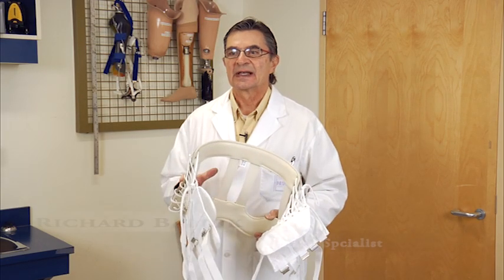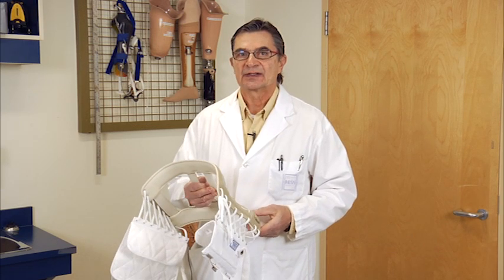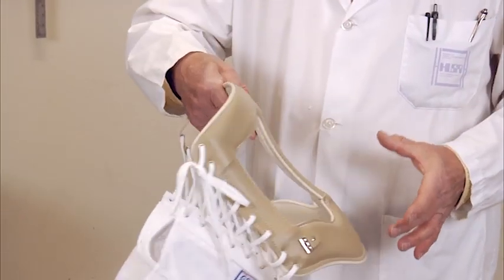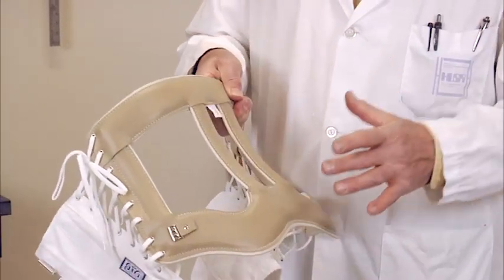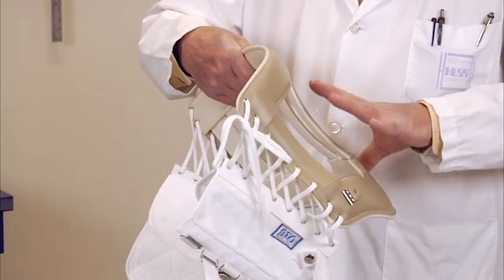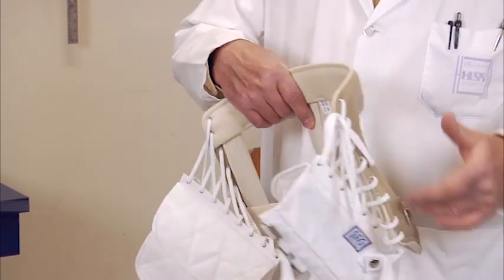We're going to go through the process of applying the chair back brace. It's one of the most common braces that you're going to see at acute care facilities. There are two different styles of chair backs, but structurally they're the same. The brace has a superior and inferior band. We'll show you where these bands should be sitting on the body, and on each side are lateral stays.